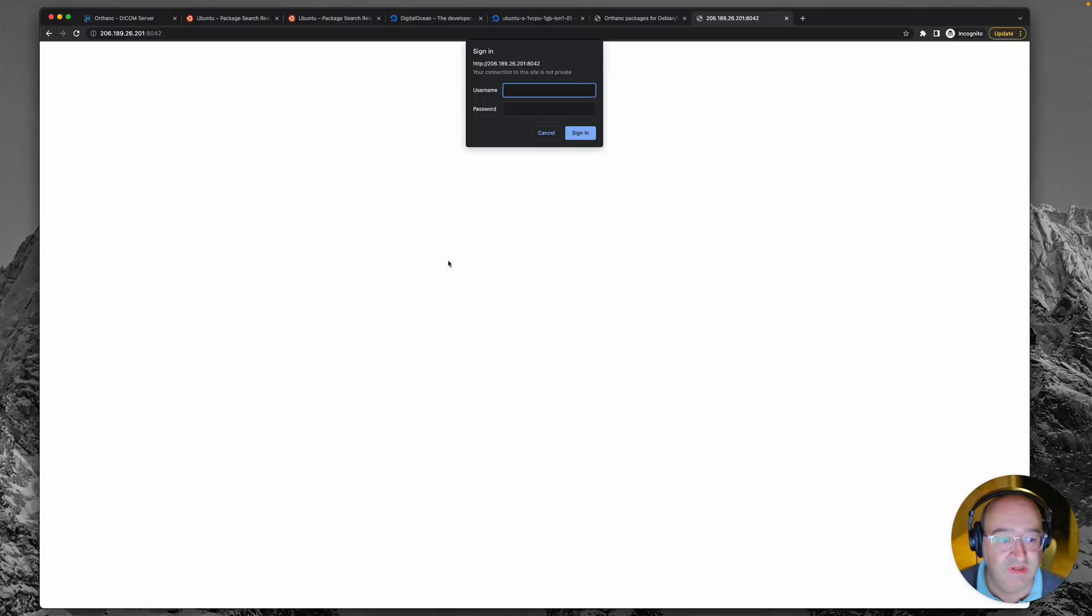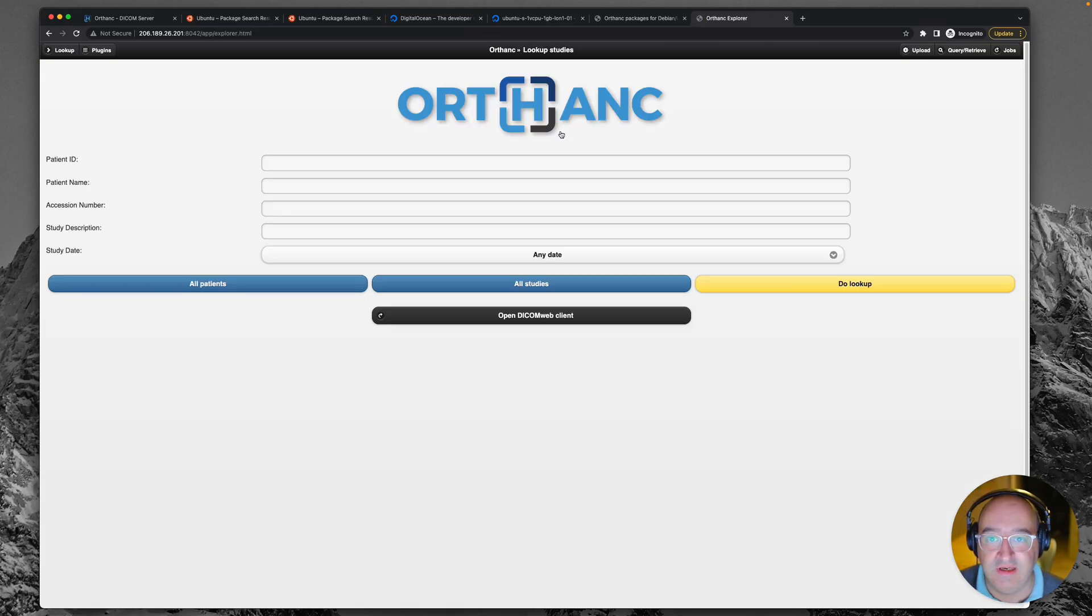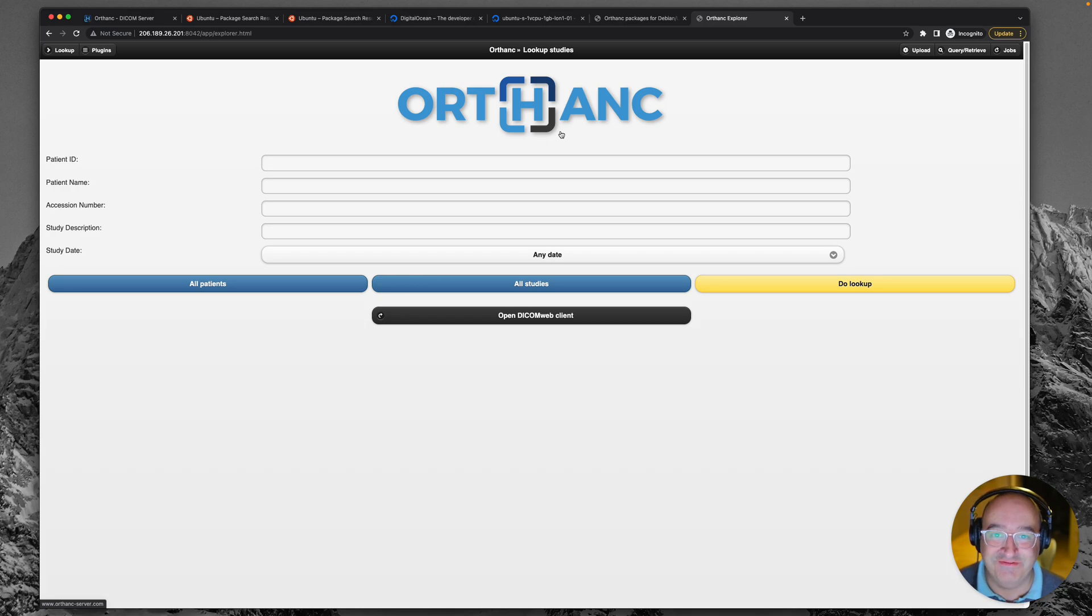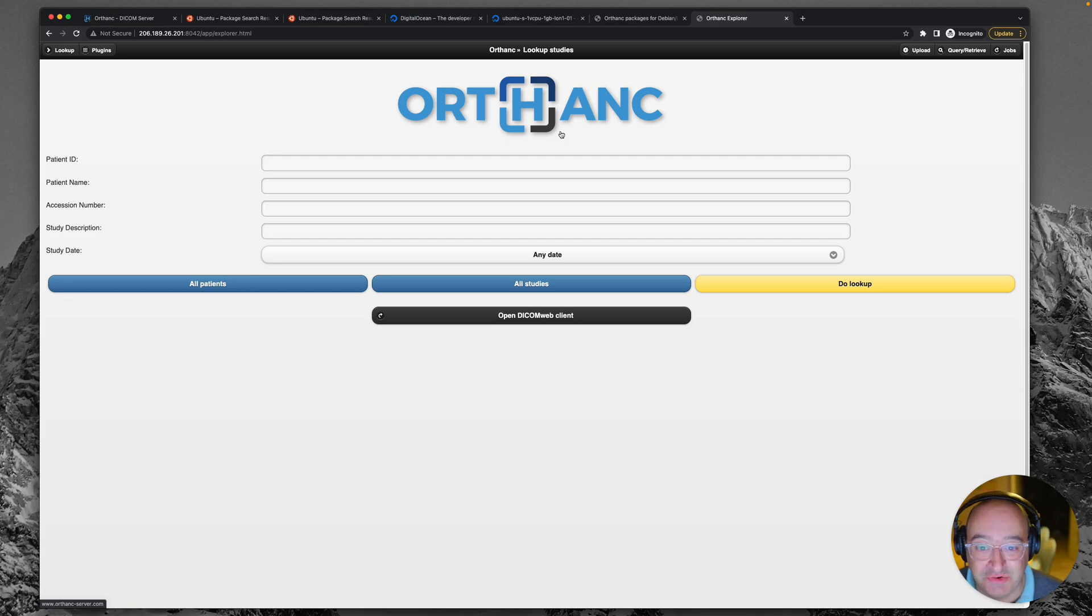So I'm back here again. Let's try it. Orthanc. Orthanc. Enter. Hurray. We've made it. Look at that. That is our live personal Orthanc packs.